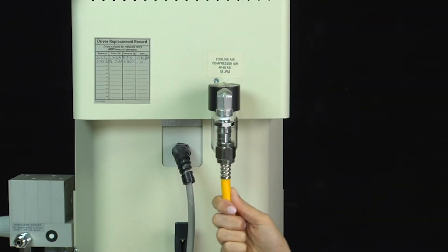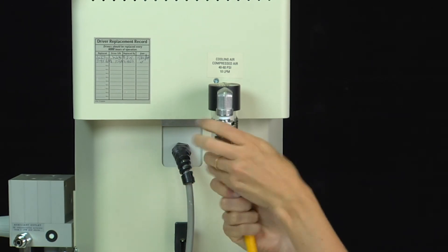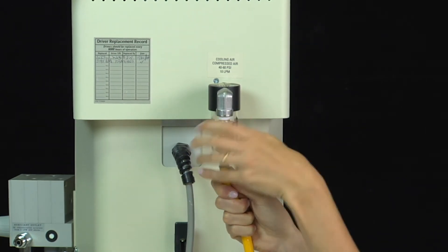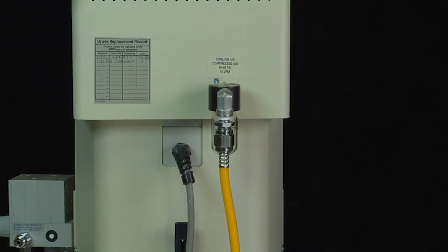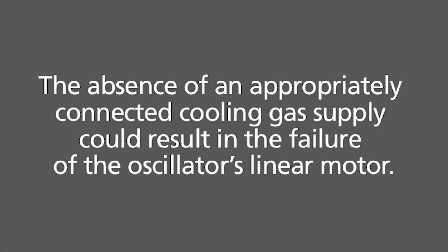A second DISS connection is labeled cooling air. This connection accepts a 50 PSI compressed air supply, which cools the oscillator. It's important to note that the absence of an appropriately connected cooling gas supply could result in the failure of the oscillator's linear motor.